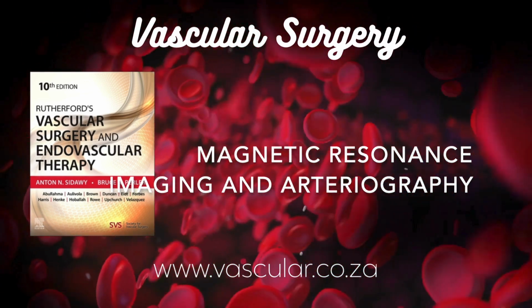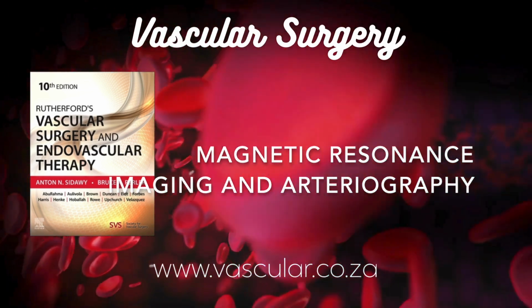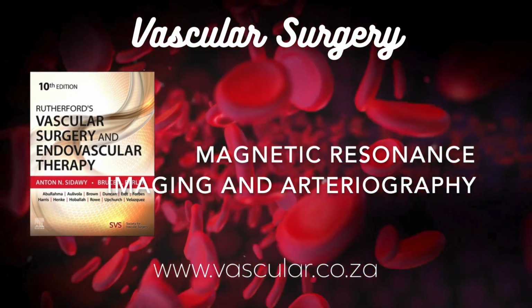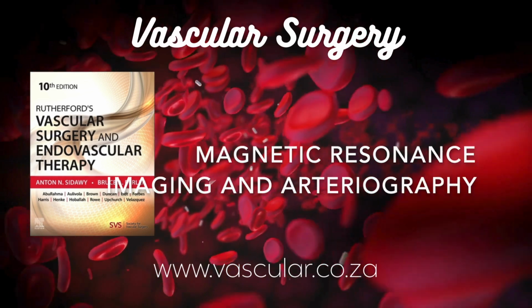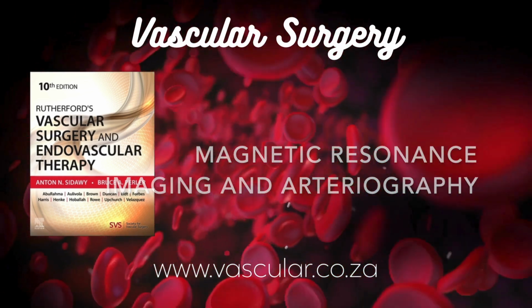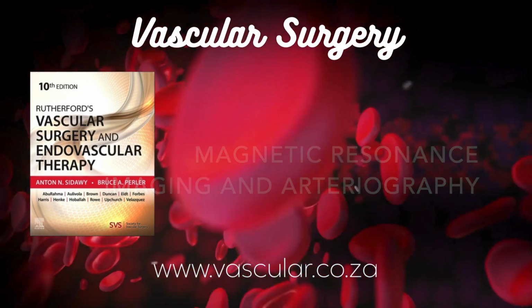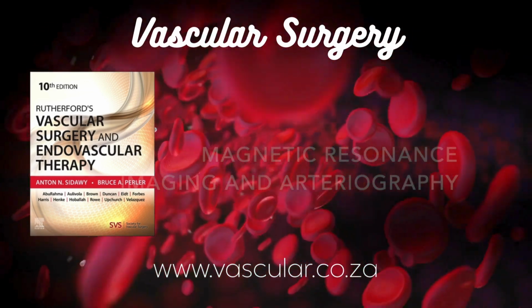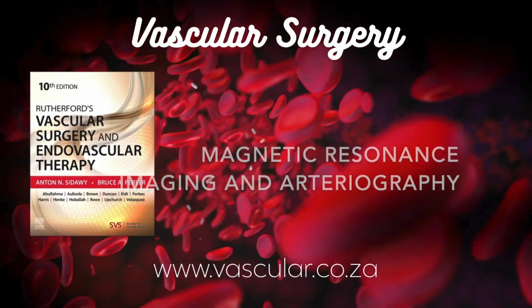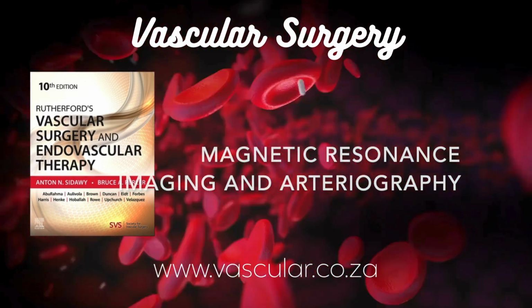And one more. Something about old blood clots? Right. Blood clots that are a few days to a couple of weeks old contain methemoglobin. Methemoglobin happens to be naturally bright on T1-weighted images. So it looks like contrast. Exactly. It can mimic contrast enhancement within a vessel, potentially hiding a real blockage or making you think there's flow where there isn't. That's why getting pre-contrast T1 images first is often important to see if anything is already bright before the injection. So definitely pitfalls to be aware of during interpretation.